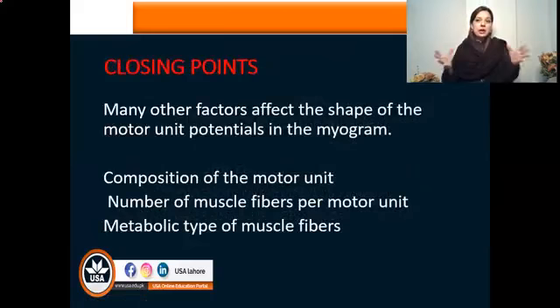So let's discuss the closing points of this lecture. Let's revise what we have studied. We said electromyography is a clinical technique which records the electrical activity of the muscle. And why do we measure this electrical activity? I want to get information about the structure and function of the muscle fibers so that we may compare and get an idea of how we are going to progress and what the possible prognosis is. What interventions we need to do, what would be the short-term goals, and what would be our long-term goals.